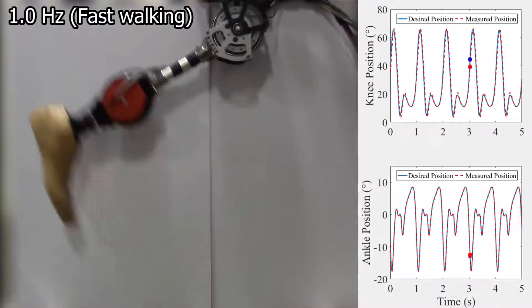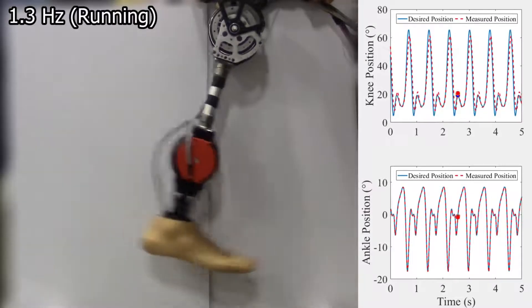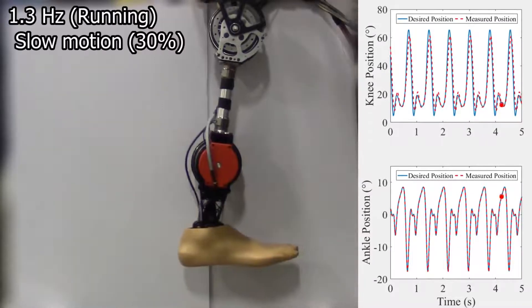Additionally, we show that the leg is completely capable of supporting position-based control paradigms for the full range of walking speeds and some running speeds.